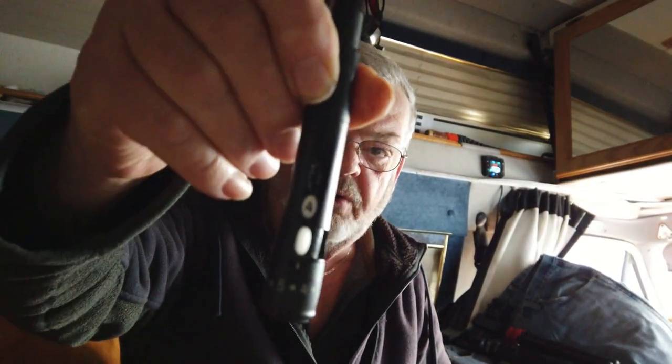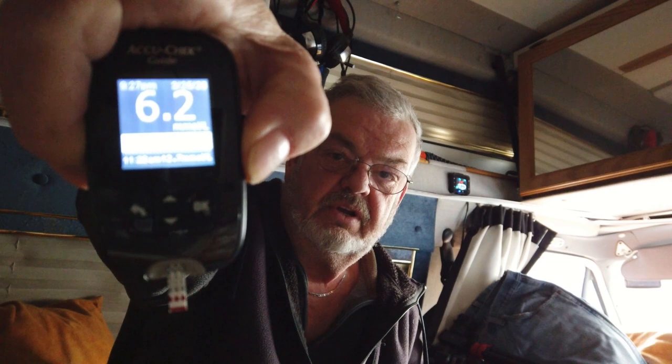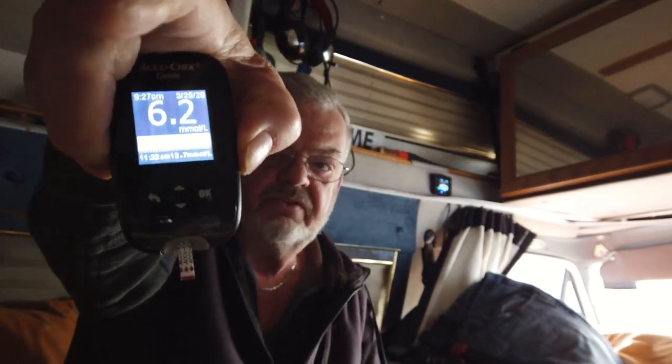Good morning guys, it is now 9:30 in the morning and it's time to do another reading. I'm a little nervous this morning because maybe I just got lucky last time. Here's the meter with the strip ready to go. My lancet is set to number four — give the old prick, get some blood going. Before breakfast, supposed to be between 5 and 7 for a non-diabetic — 6.2. We're good!